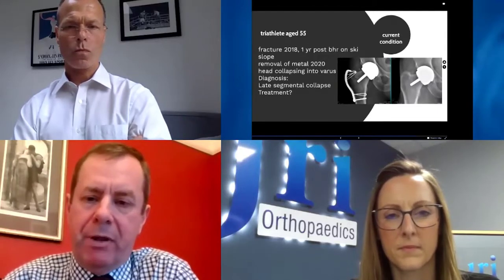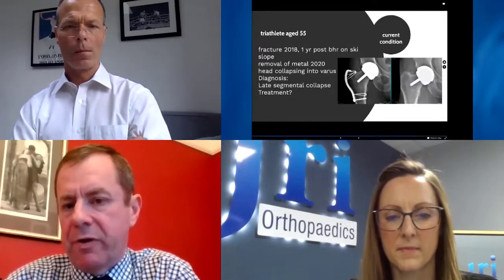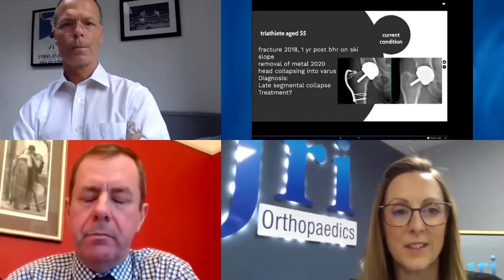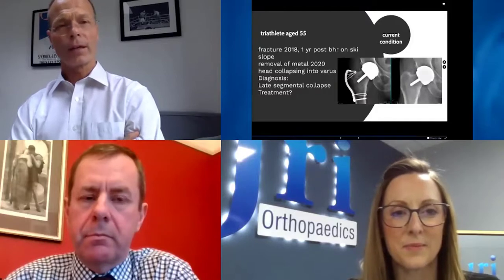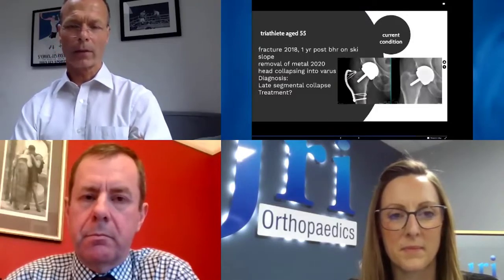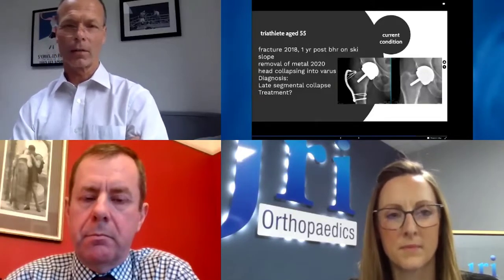I'm sure there's someone out there for whom it's not big enough, and there's always a cemented option on the shelf in case it's not, but I've not come across that situation so far. Okay. Johan, do you have anything to add to that? Well, I must say, if it is looking like it's going to be a really massive stem, I have actually gone back to use the traditional Furlong stem, which I still think is a really excellent stem.